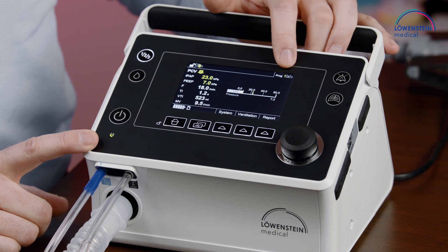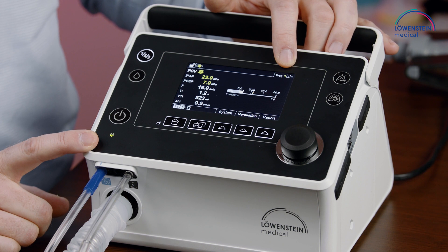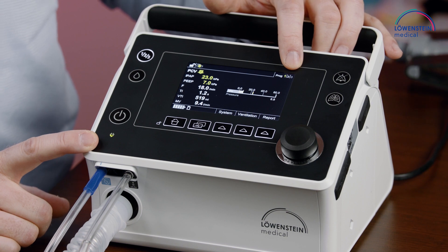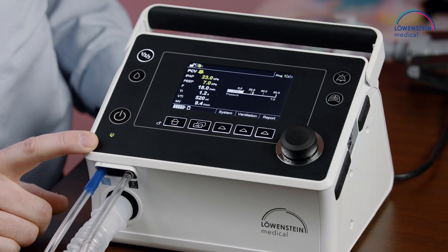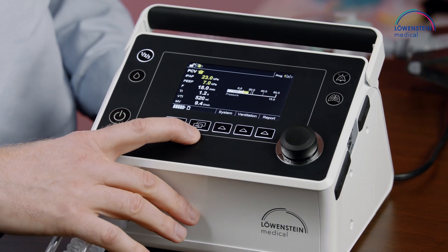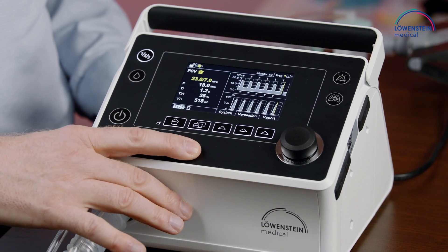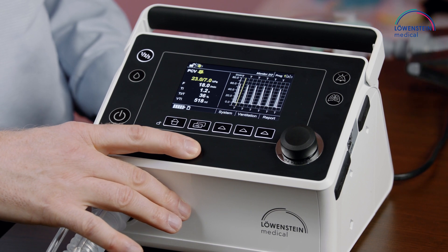Here is the display of the program — the used program is shown in green. Also available programs are white, and not available programs, like number three in this case, are gray. This is the home button, and this is the button for different views like pressure and volume curve or flow curve.